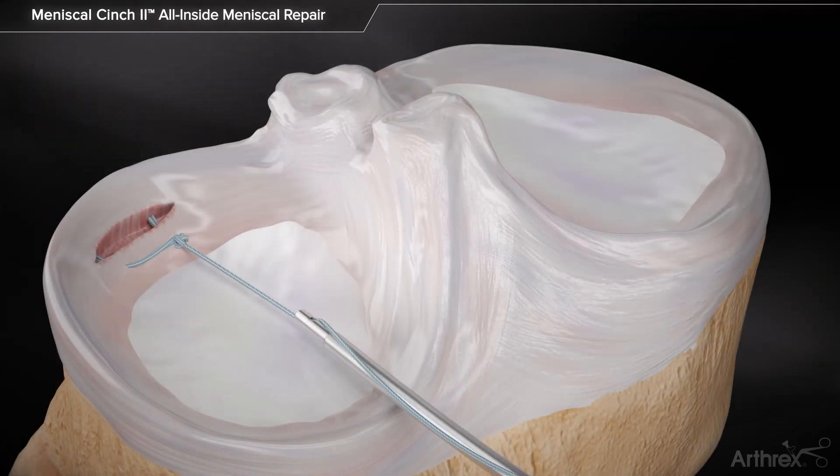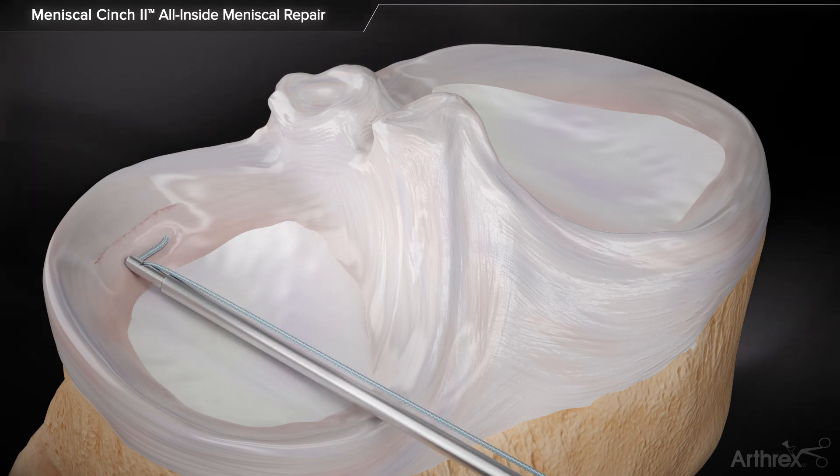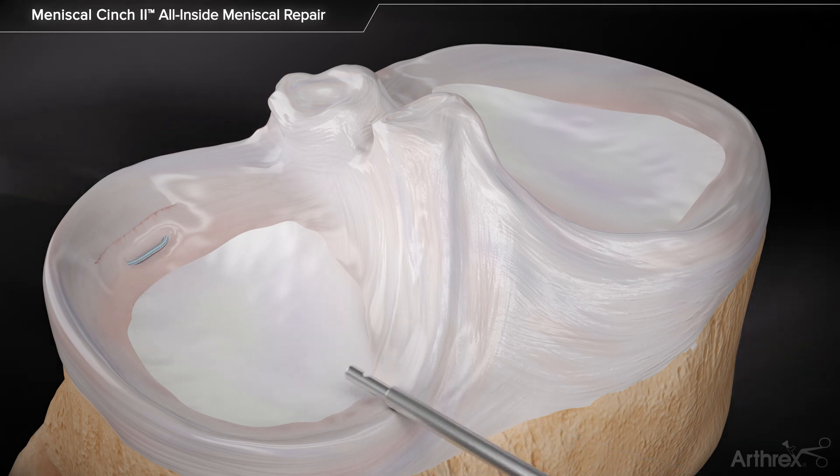Advance the Knot Pusher Suture Cutter towards the second implant. Apply tension to the suture while using the Knot Pusher to advance the sliding knot towards the first implant. Countersink the knot and sever the suture.